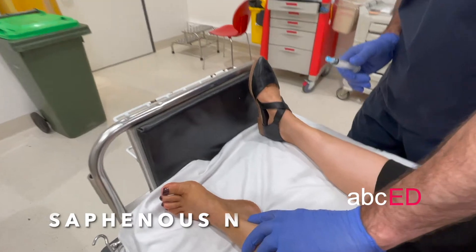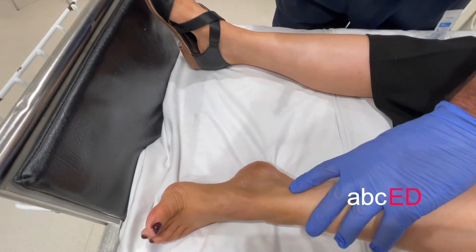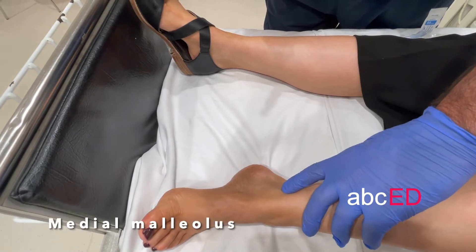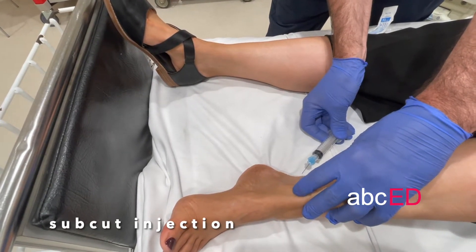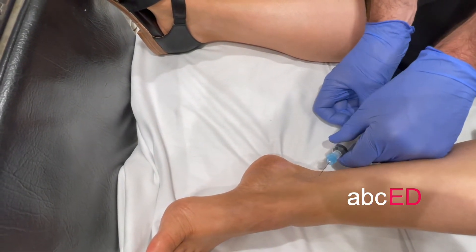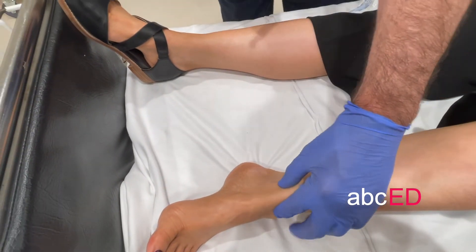The first block is the saphenous nerve block, which blocks the area of the medial malleolus. This is done by going just proximal to the medial malleolus — it's really just a subcutaneous injection. We come in all the way here to the skin, pull back, and usually inject five mils into that space, and that'll block the saphenous nerve.